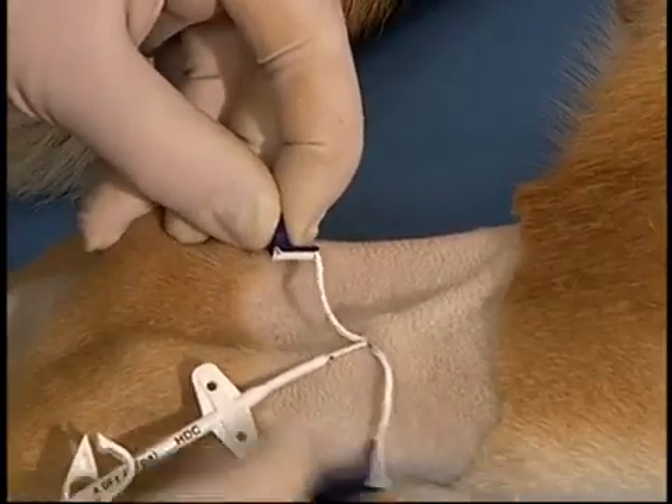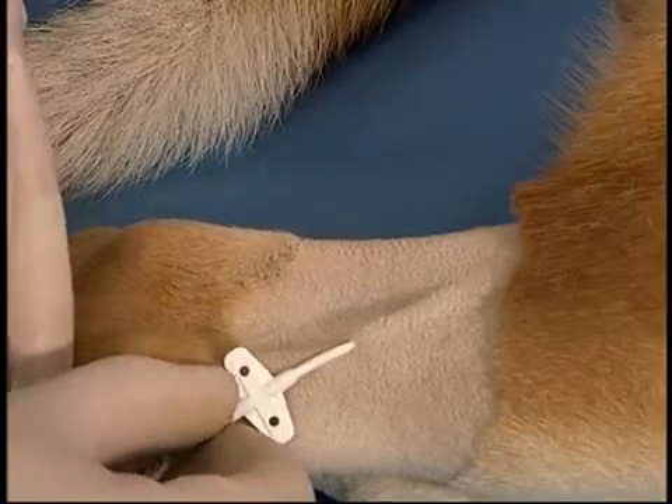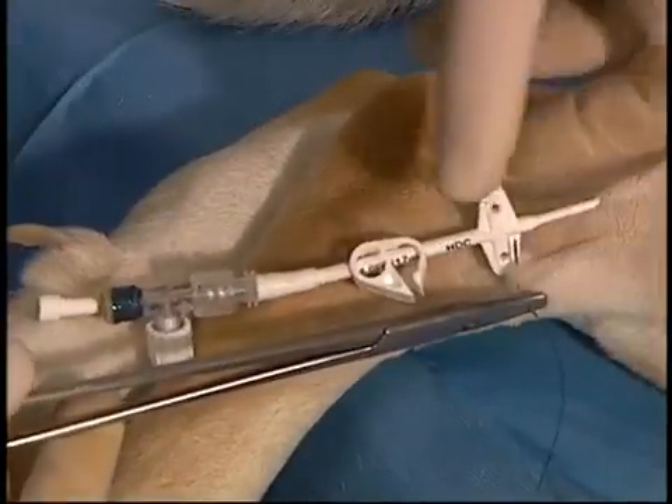The catheter is then sutured to the skin. If an insufficient prep has been done, it is very important to do a further prep at this time rather than suturing through fur.